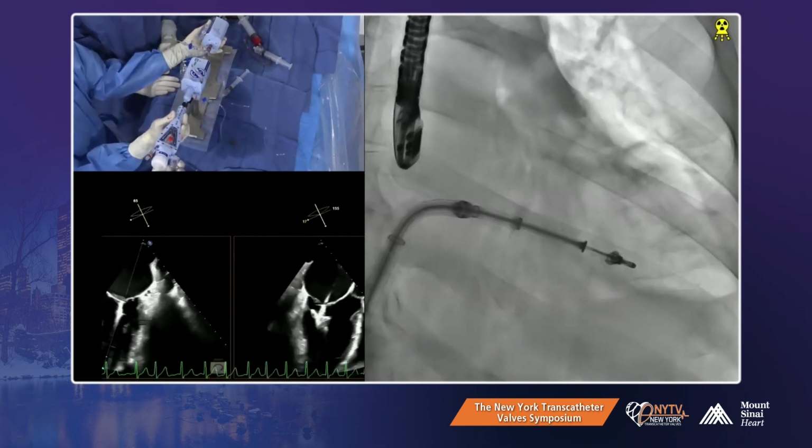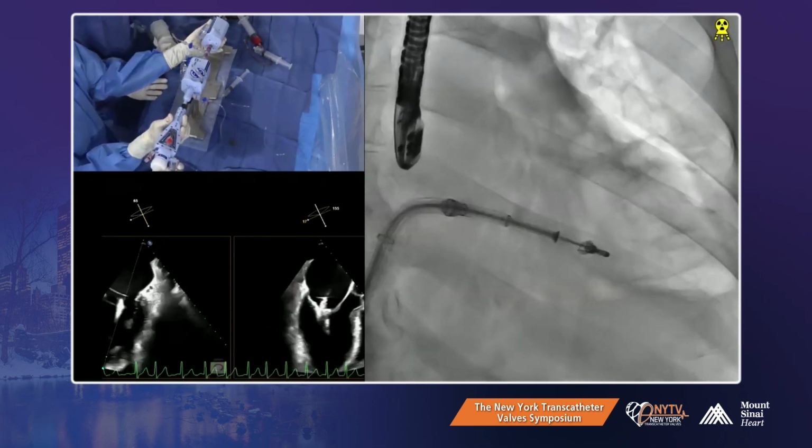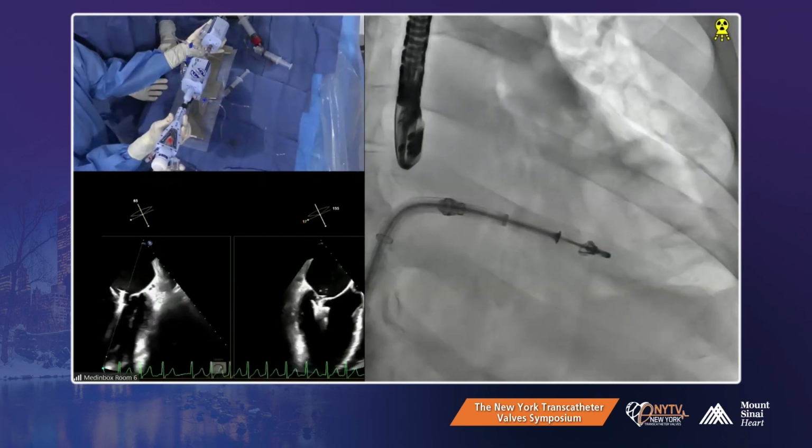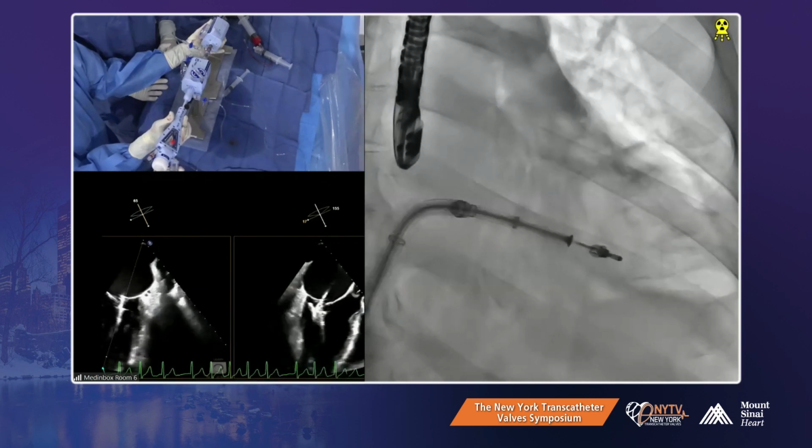Another point is, will anybody think about changing to the NTW? Nothing to do with the... Keep the same transseptal slit. Yeah, it's the transseptal, yeah.